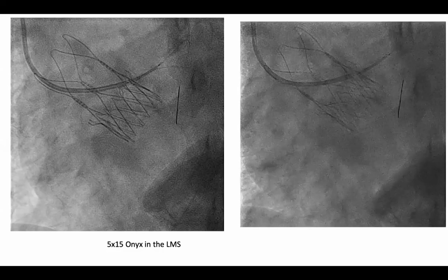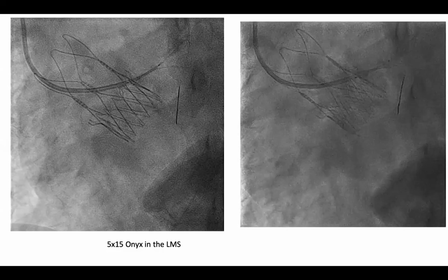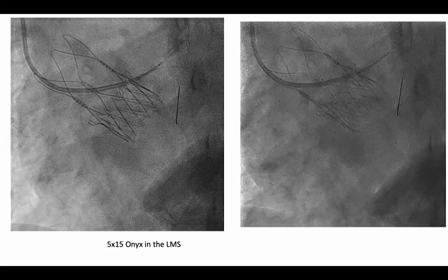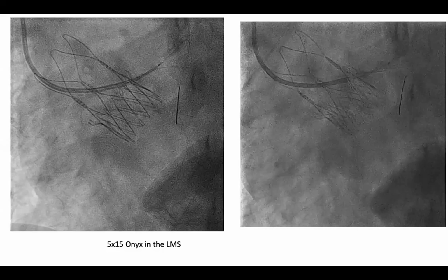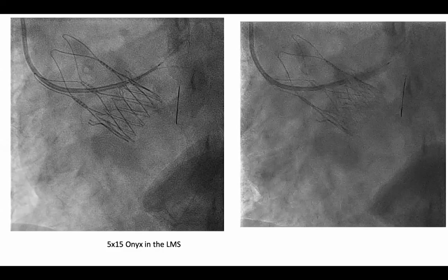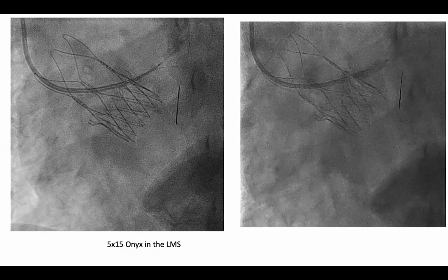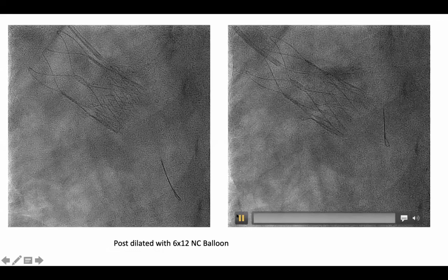You can do a quite neat and clean job very quickly. But with this, you've done a wonderful job in this case, I must say, because these long nose catheters are not easy to engage into the coronaries through the TAVI valve struts. But for diagnostic, you always use Judkins, and you will be able to get through.